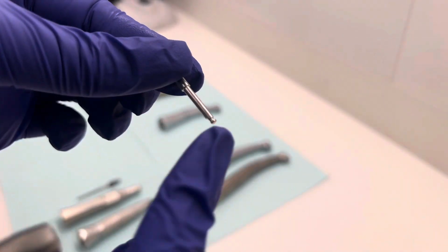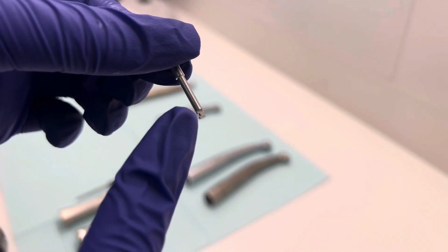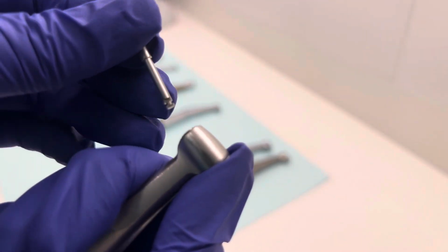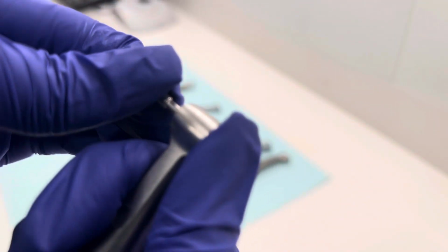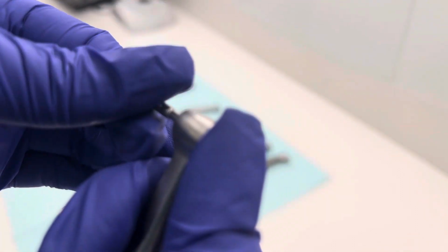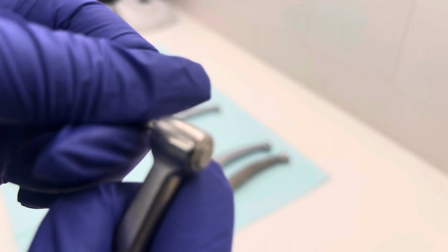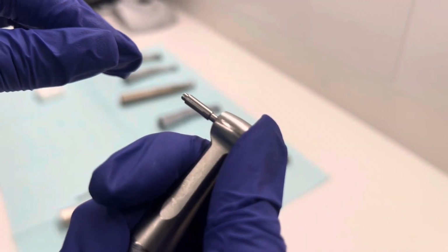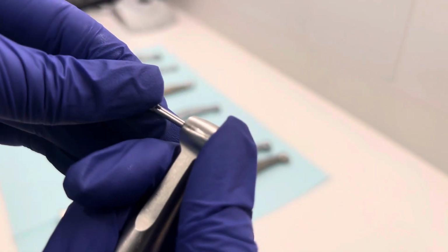And as you can see, I'm using a latch type burr. And those are the type of burrs that can be used with slow speed handpieces. They're usually used for things like spinning a cutting burr or a prophy cup, and also for removal of caries and refining cavity preparation, performing prophylaxis and other endodontic and implant procedures.